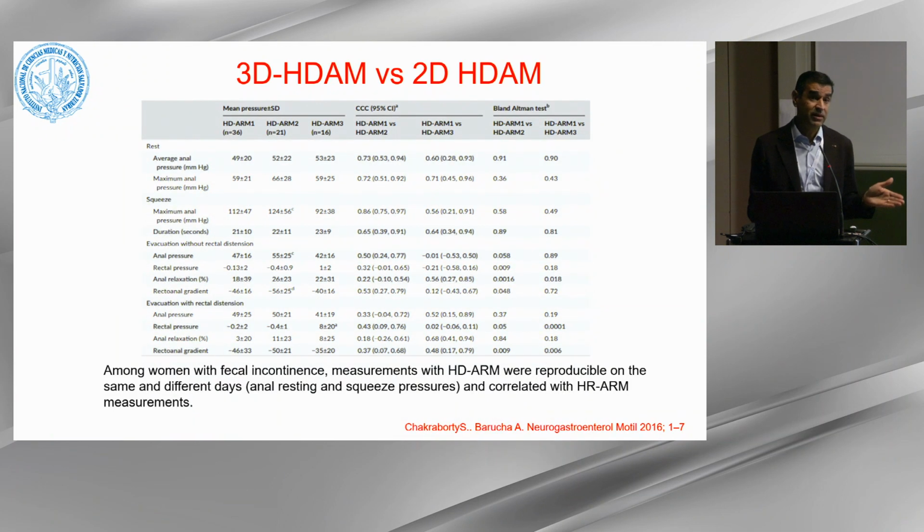They also compared the reproducibility of this 3D technology, and they found that for resting pressure and for the squeeze, it was very, very similar when doing this study on different days in the same patient. So they came to the conclusion that this technology correlates with high-resolution manometry, but there are some subtle changes that we have to take into account.